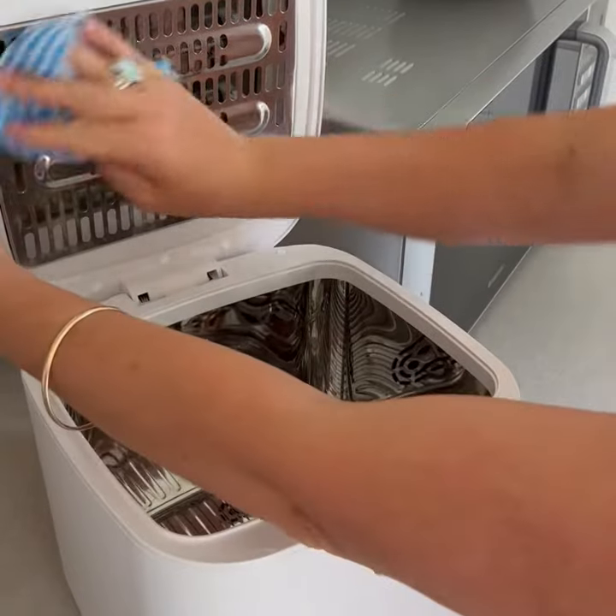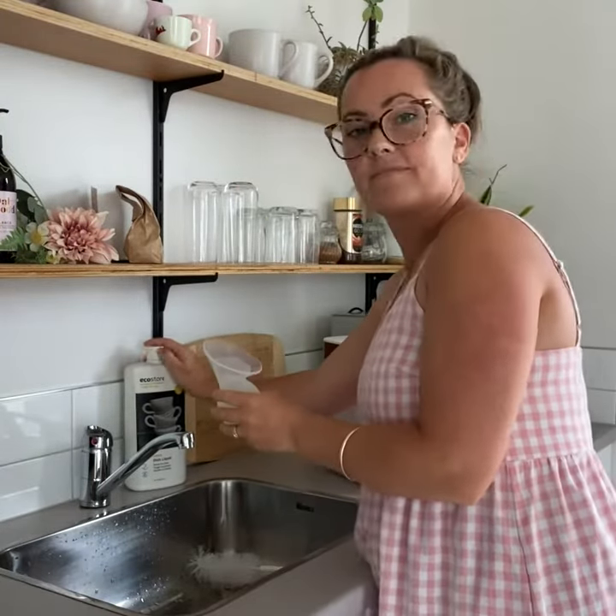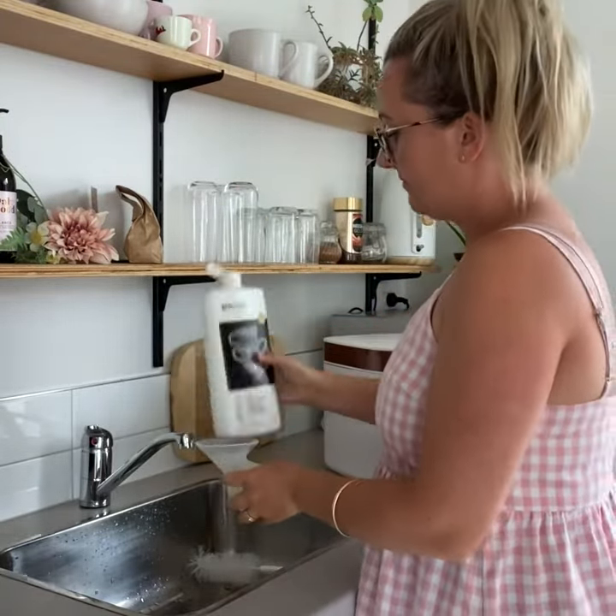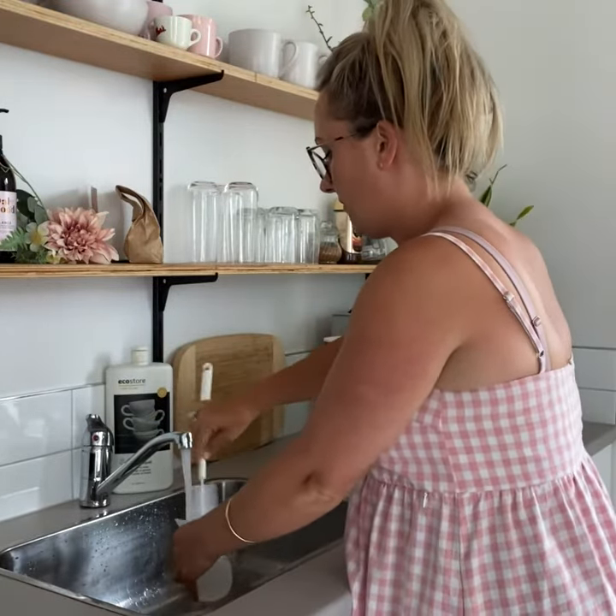Before using, wipe the inside clean with a damp cloth. Then, when your steriliser is ready, wash the items with warm soapy water, making sure to shake off the excess water before you place them inside the unit.